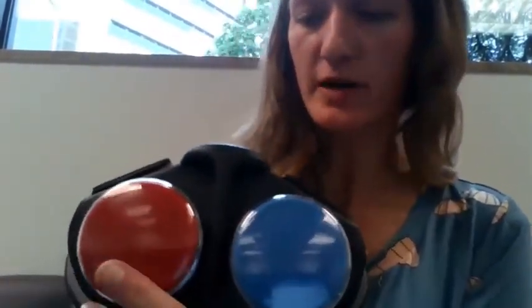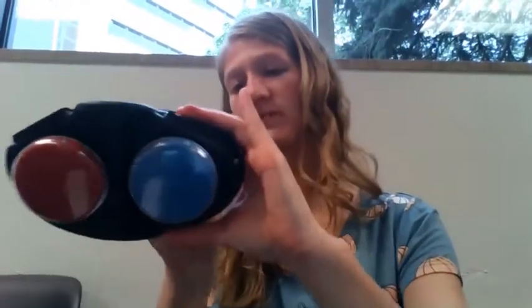To record my voice, I press the button at the top, this button here, and I press one of the buttons here as I'm recording. So let's say I want to say, I need help. I would press the red button and the red button in the back at the same time. I need help. And then release. Then when you press it, wow, the volume wasn't very loud. I need help. It records.